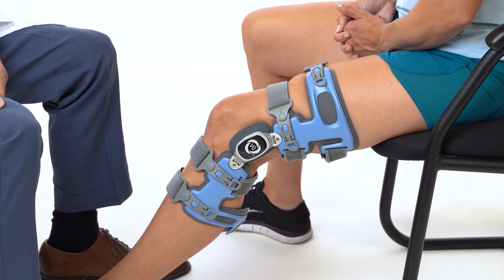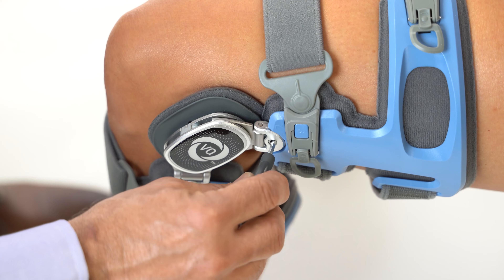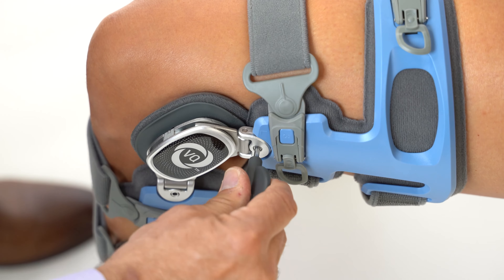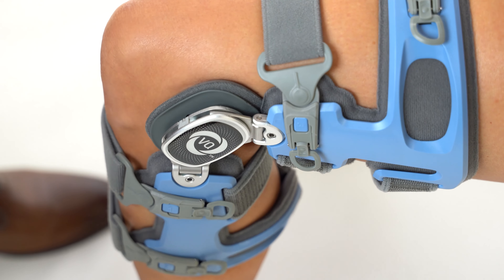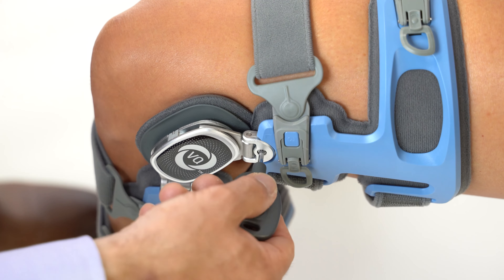With the brace in neutral, bend the knee to 90 degrees. Using the provided adjustment tool, turn the upper Q-hinge screw one-eighth turn clockwise to increase lateral compartment relief, or one-eighth turn counterclockwise to increase medial compartment relief. Repeat for the lower Q-hinge screw. Stand and walk a short distance to ensure comfort and proper correction after each adjustment.